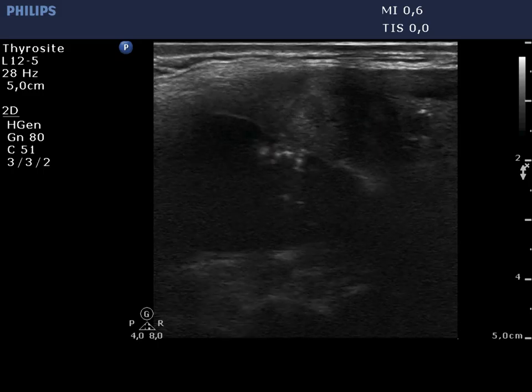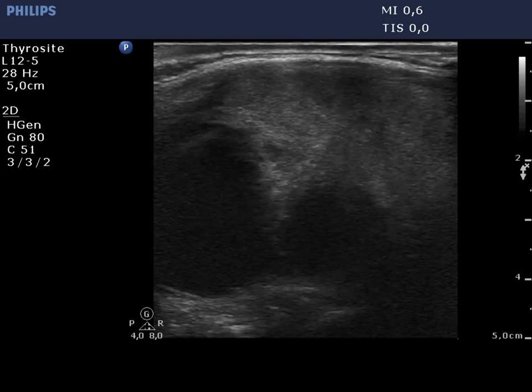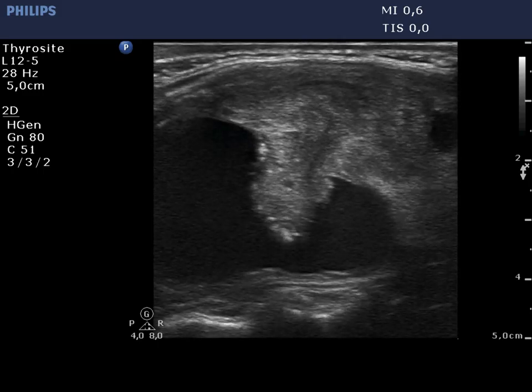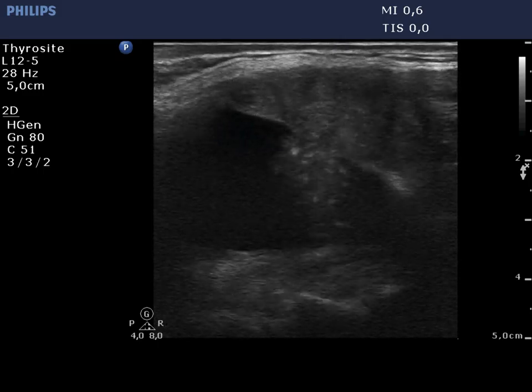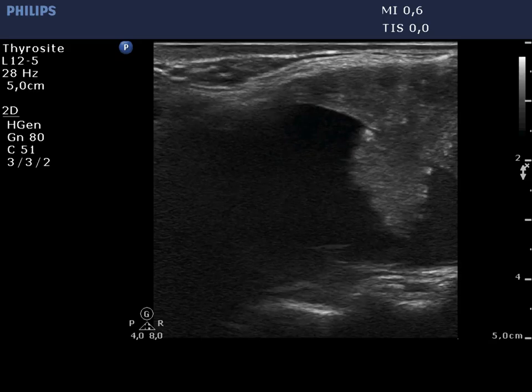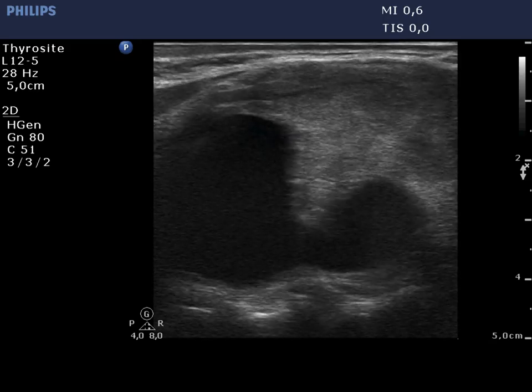This is a peripheral type cyst. The angle between the projection and the flat area of the solid part is acute.